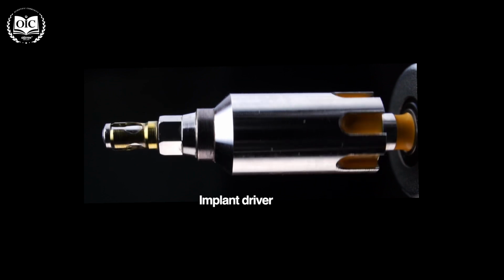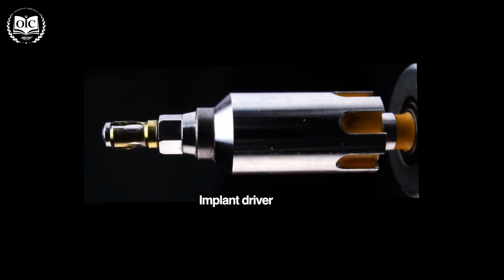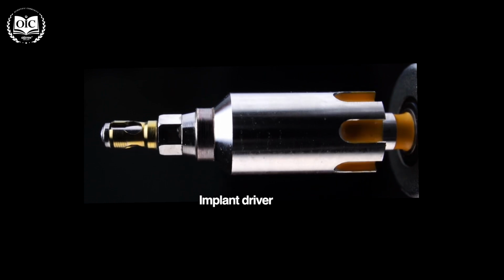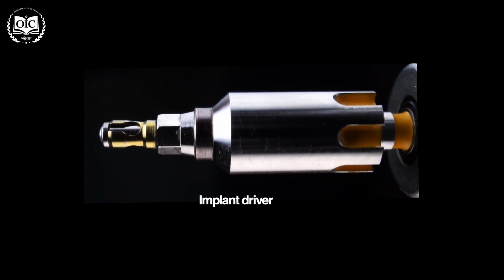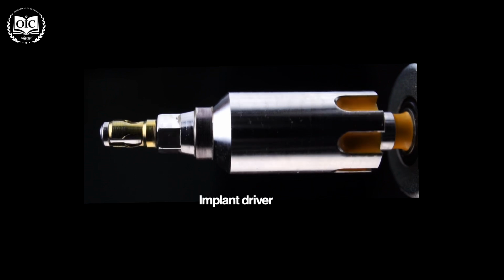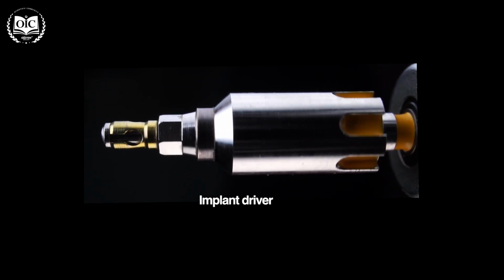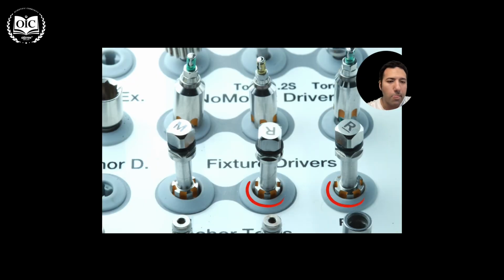Then come the implant driver with the 6 yellow marks on the neck of the driver that indicate the direction of the hex inside the implant. And we always use the hex orientation timing to adjust implants in full arch reconstructions for the angles of the multi-unit abutments to match together, minimizing discrepancies in the parallelity between the implants, and sometimes in the immediate loading single anterior implant cases like I'm going to show you today. Also for the provisional restoration to be seated passively without problems.